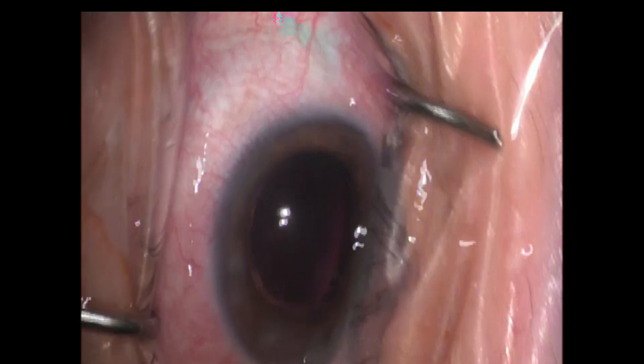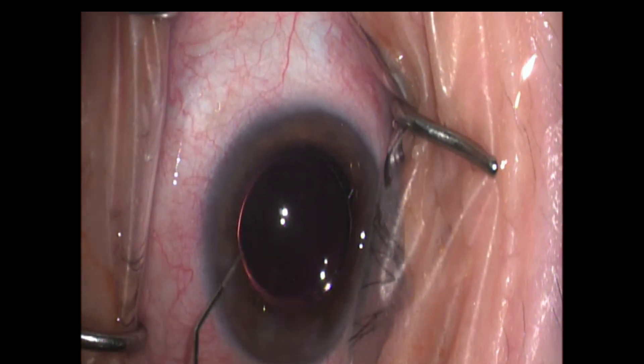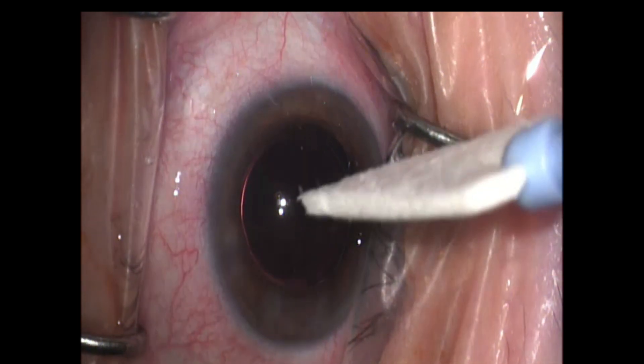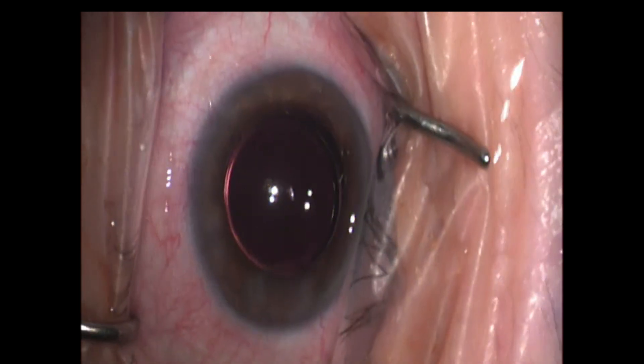We're going to hydrate our main and paracentesis wounds. I'm just going to tap the front of the eye very lightly. Here we're injecting a preservative-free antibiotic — our preservative-free Moxifloxacin — at the same time. Tap the front of the eye to make sure it's nice and soft and we're good. Thanks for taking the time to watch this video.